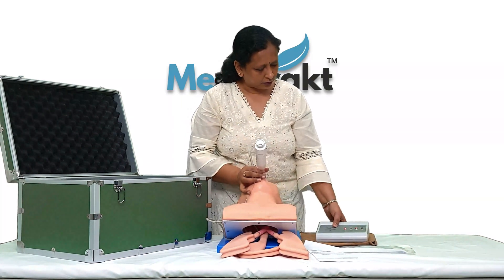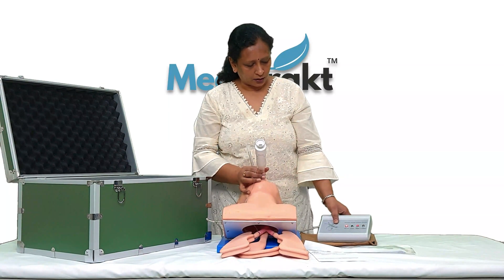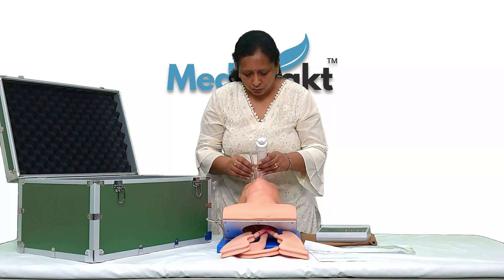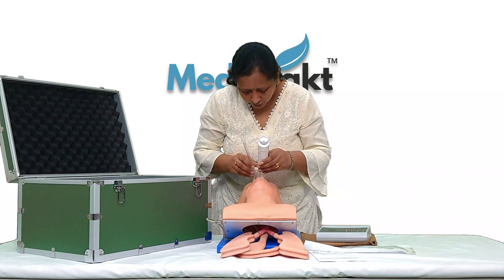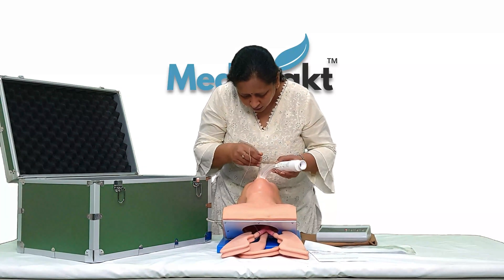I have done this round of intubation — it's in the stomach, which is wrong. We need to do it correctly so the pipe goes into the trachea.